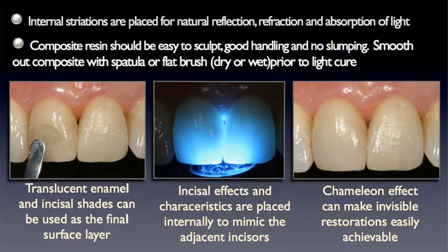You can see how the blockout is really quite nice interproximally. It's very natural in the blockout. I hope you'll agree with me on that. And this is 2 years post-op.